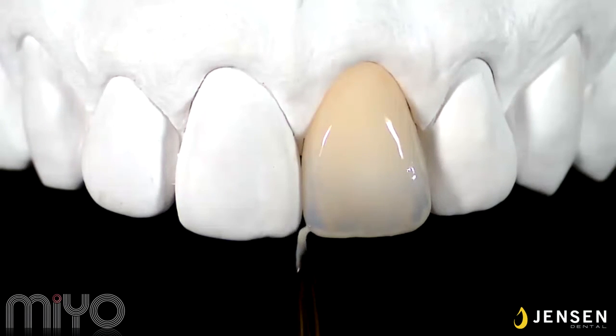Use stained linen and snow to finalize all the effects, adding a stronger contrast to all the translucent colors that you applied. Here I'm using stained linen, creating my final illusion, making all the effects pop into a three-dimensional look of a layered ceramic on the incisal 1/3 region. And some spots to create the stronger contrast.